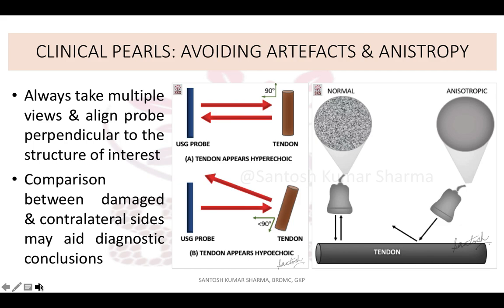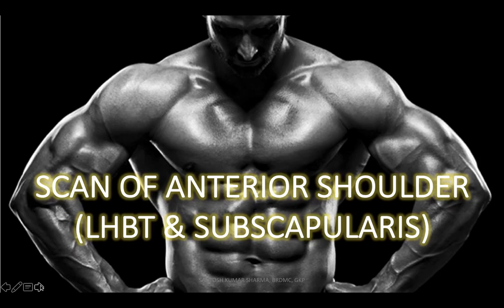So, in order to avoid this artifact, we should always take multiple views and align the probe perpendicular to the structure, and also we compare from the contralateral side to get diagnostic conclusions.